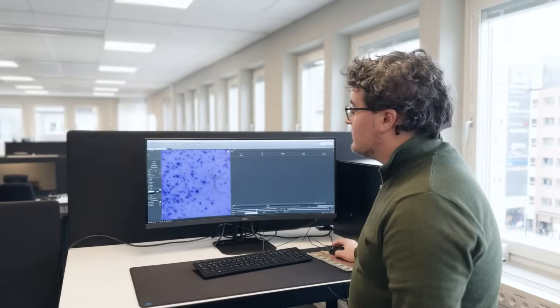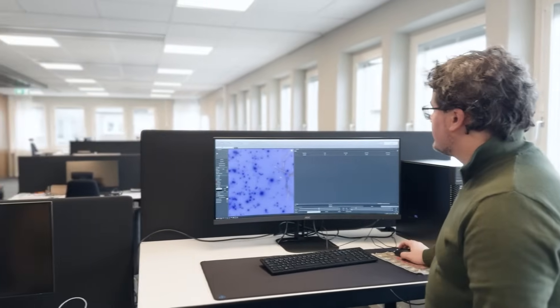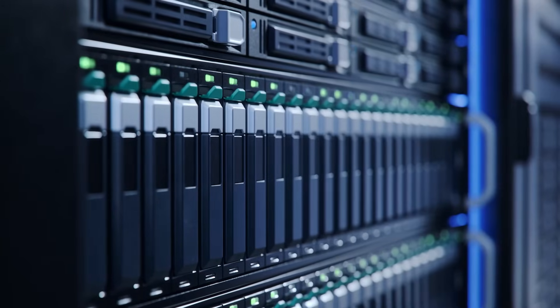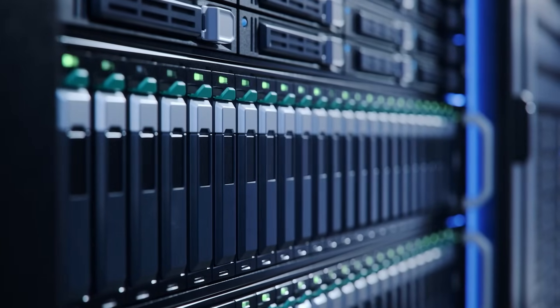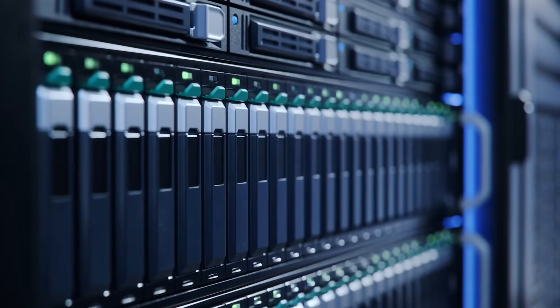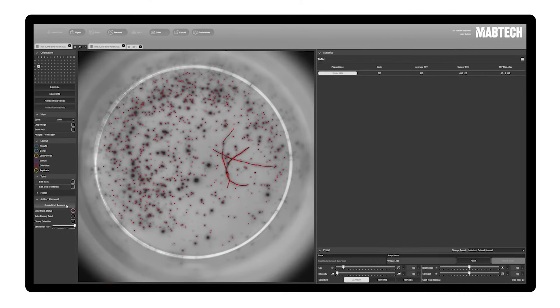To detect these artifacts reliably and in real-time, Camcom's solution leverages the power of GPUs to compute robust features that sharply discriminate artifacts from genuine spots.